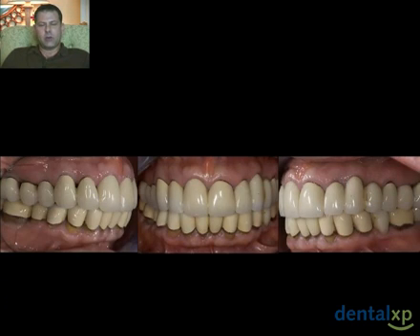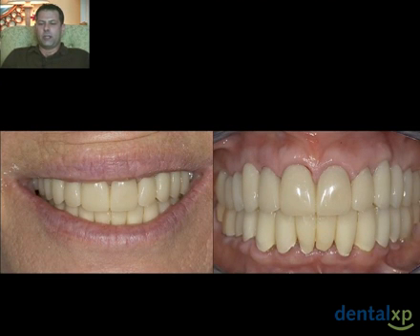And if you look intraorally, you can see why she's unhappy. She's had some recession along with some periodontal surgery to try to eliminate the bony defects. Unfortunately, she still has some failing teeth due to some hemiseptal defects on the posterior teeth. So the first thing we do in these types of cases is provisionalize the patient, try to mold the soft tissue, and the way we were able to eliminate the periodontal disease in this patient was by extracting some teeth. The plan was to extract the periodontally infected teeth, place some implants, and then restore them.